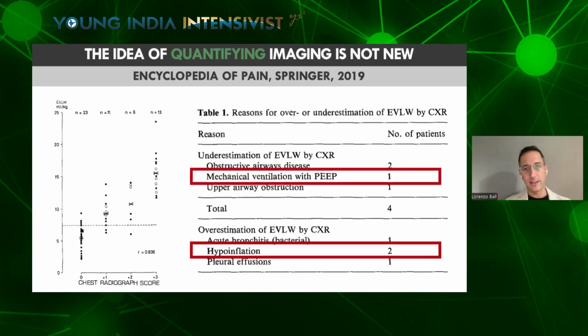But on the other hand, in this paper, even if they do not discuss it quantitatively, they understood that how we ventilate the patient, how much PEEP we apply, alters the opacity of the lungs. So even in this very early report, there was already some kind of concept of relating the function, how we interact with the patient, to what we get from imaging.